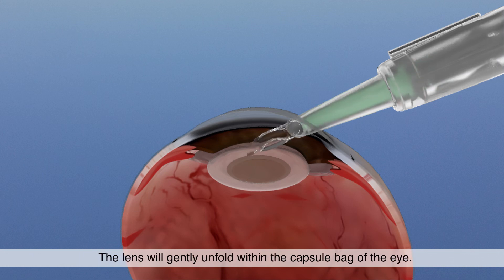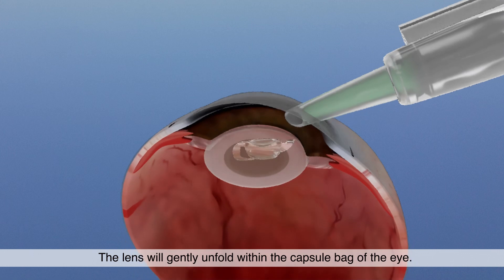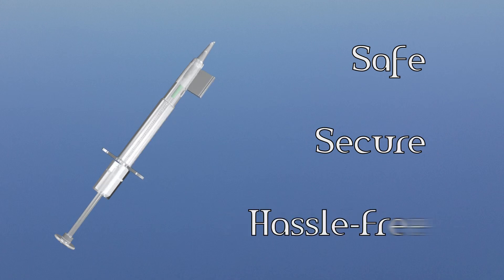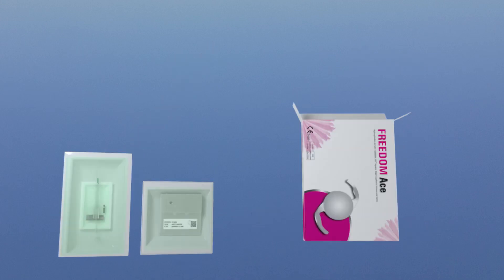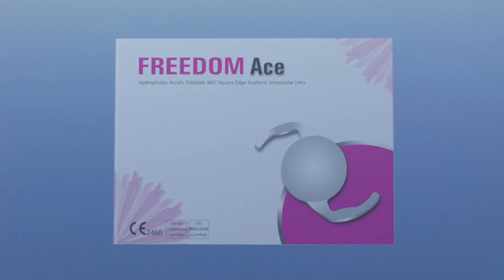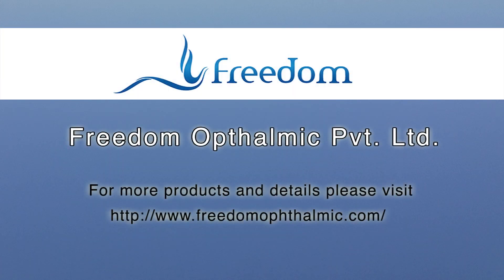The lens will gently unfold within the capsule bag of the eye. Safe, secure, and hassle-free. Enjoy using the manual loader by Freedom Ophthalmic for smooth insertion of IOL, giving your patient the experience of quality and assurance. Thank you.